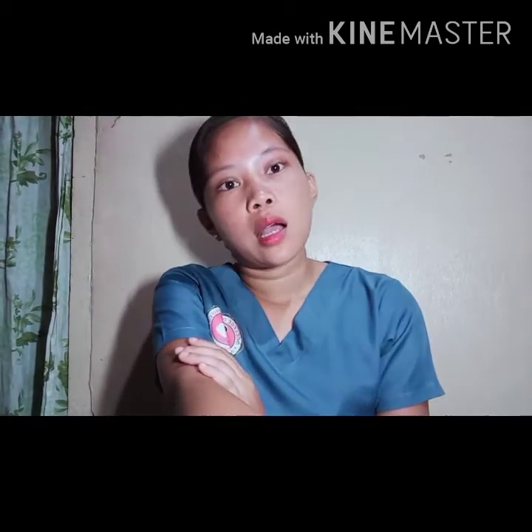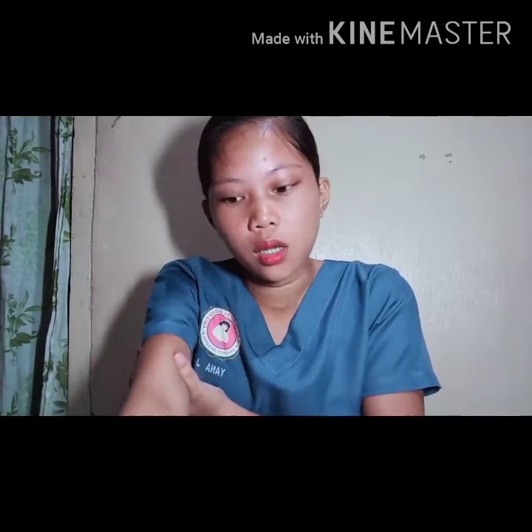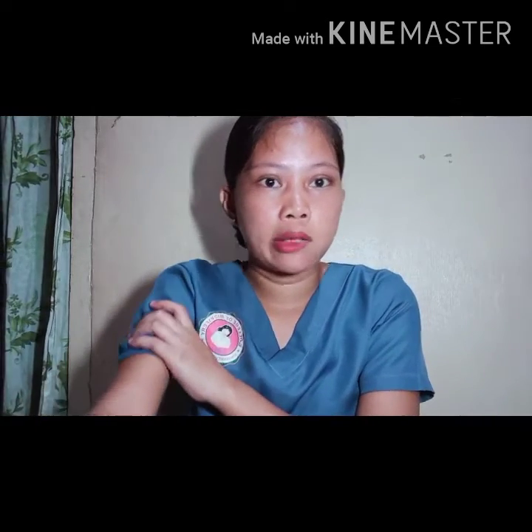So the tourniquet helps dilate the vein so the veins become clearer. If the BP of the patient is high, place it further from the venipuncture site. When you apply the tourniquet, it should be 6 to 8 inches. It should be higher up if the patient's BP is high. If low, it should be as close as possible.